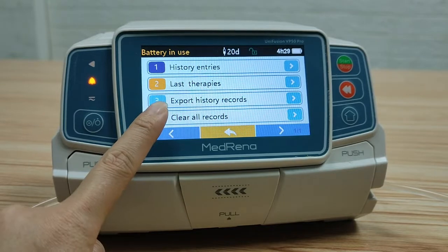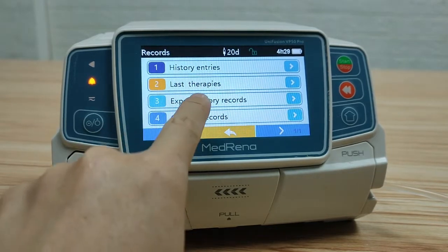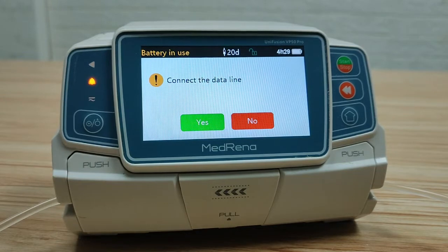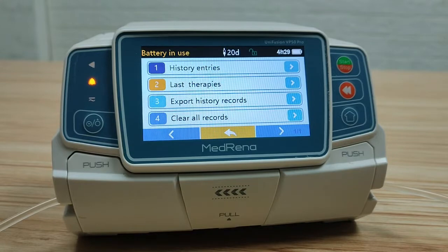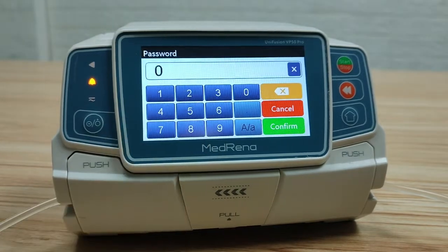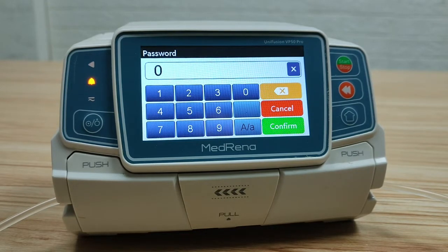Export history records: the history records can be exported to a computer by using a USB cable. Clear all records: enter password 3312 and all data of history entries and last therapies will be cleared.